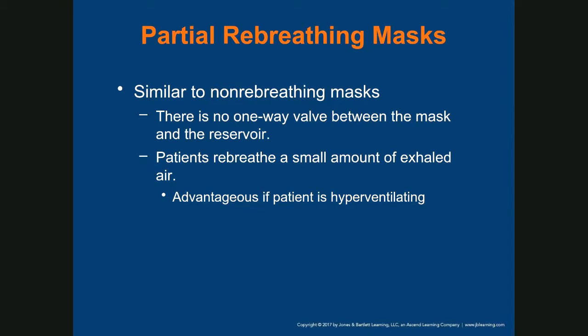So you calm the patient down. Have a conversation with the patient. Then you give them the oxygen, right? Don't just fling the oxygen on them and say, breathe. I need you to breathe. You must have a conversation. All right.